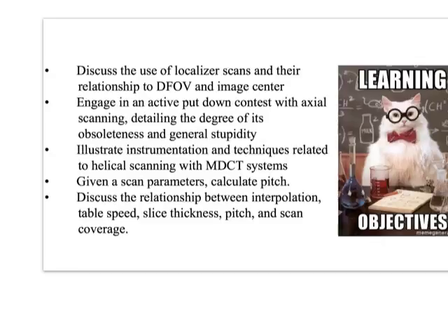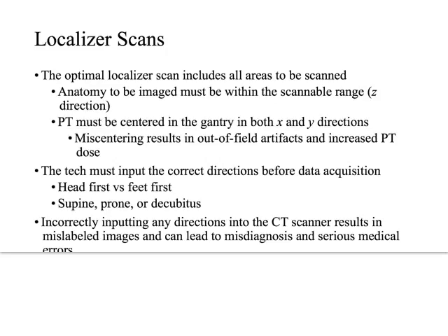So this point right here, down here at the bottom, is pretty much every CT scan ever. If you can read this chapter and come away with a good understanding of that, you are well on your way to becoming a very good CT tech. So this is a significant chapter for us. So let's talk about these localizer scans.